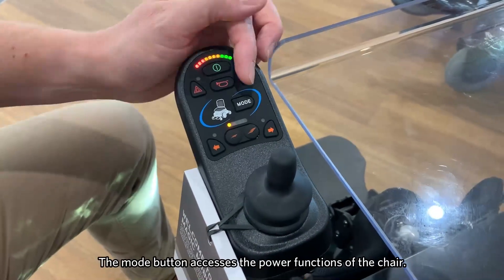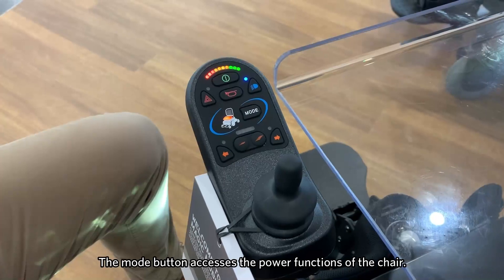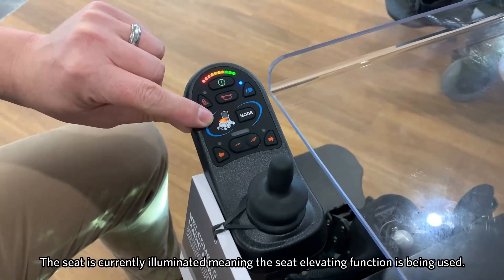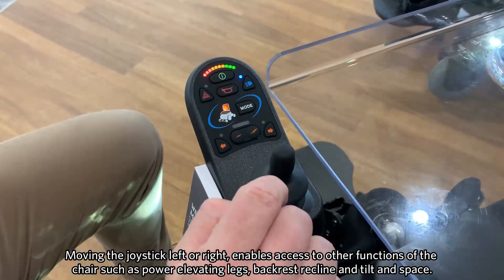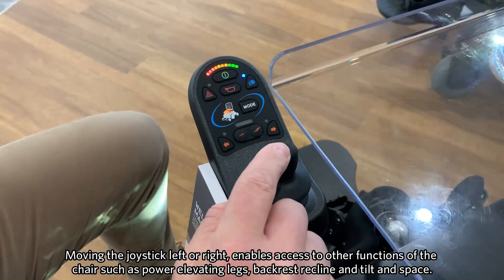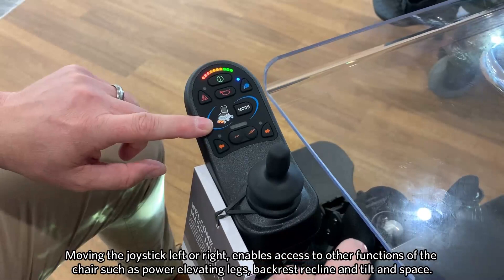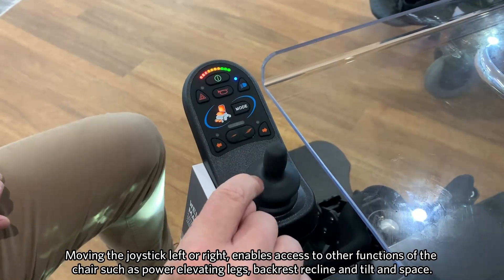We also have the mode button. If we press this, it allows us to get into the powered functions of the chair. As you can see here, the seat is illuminated, meaning that the seat elevate function has been operated. By moving left or right on the joystick, this allows us to access other functions of the chair, such as powered elevating legs, backrest recline, and tilt-in-space.